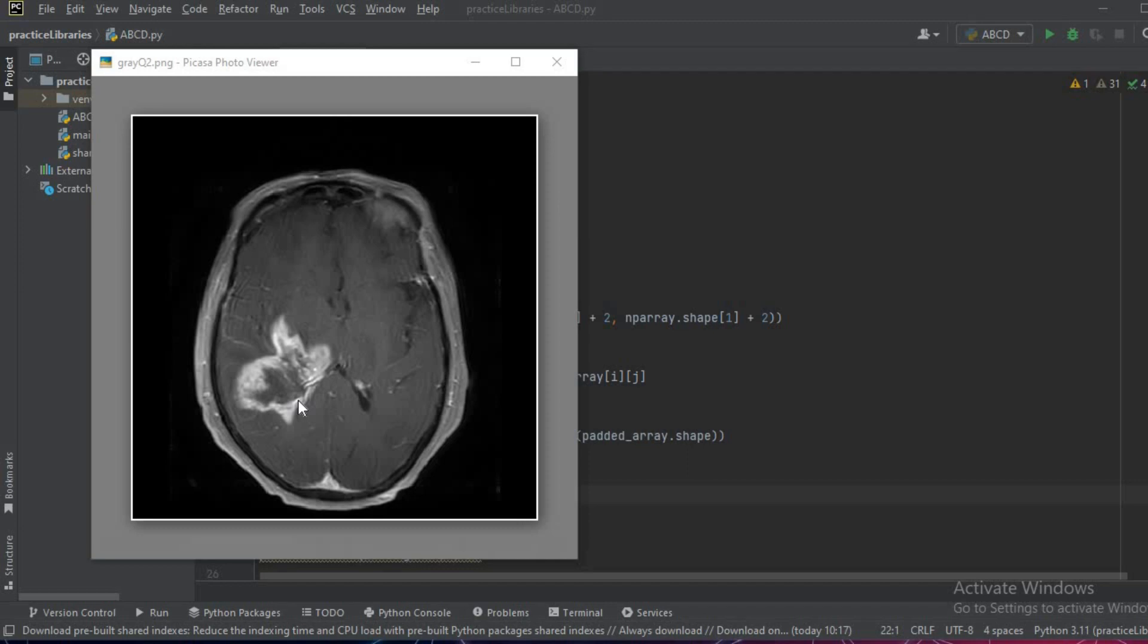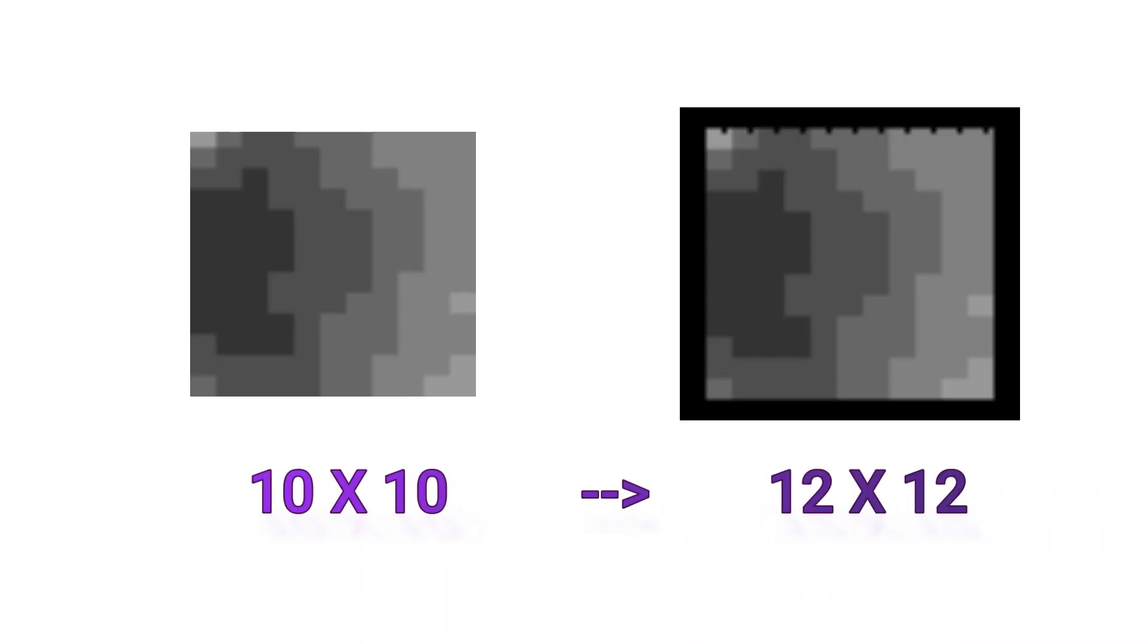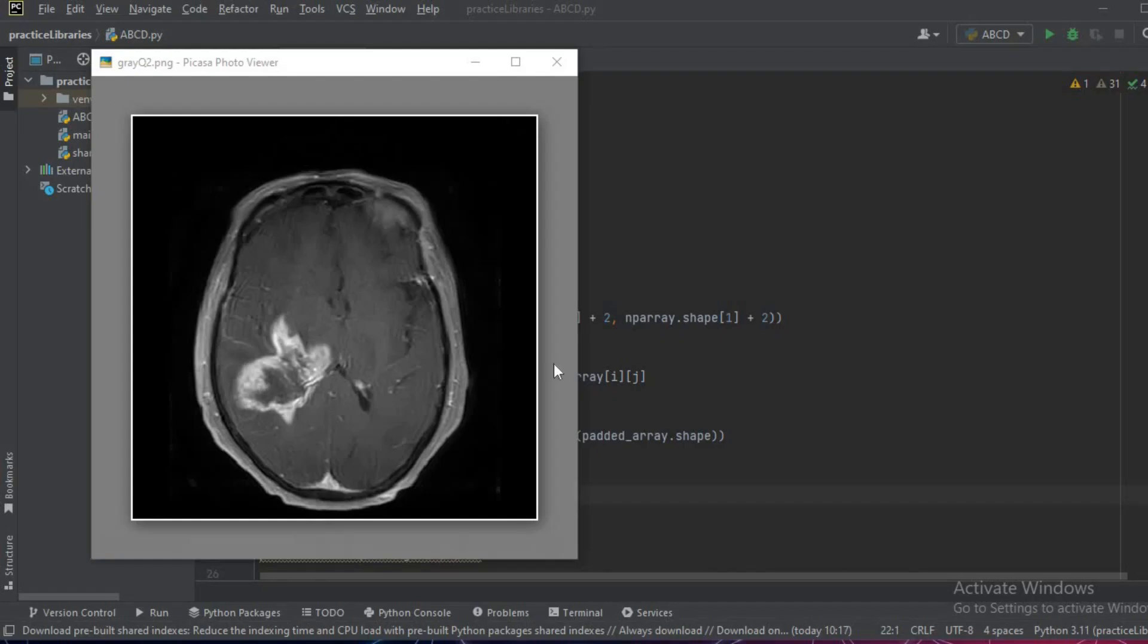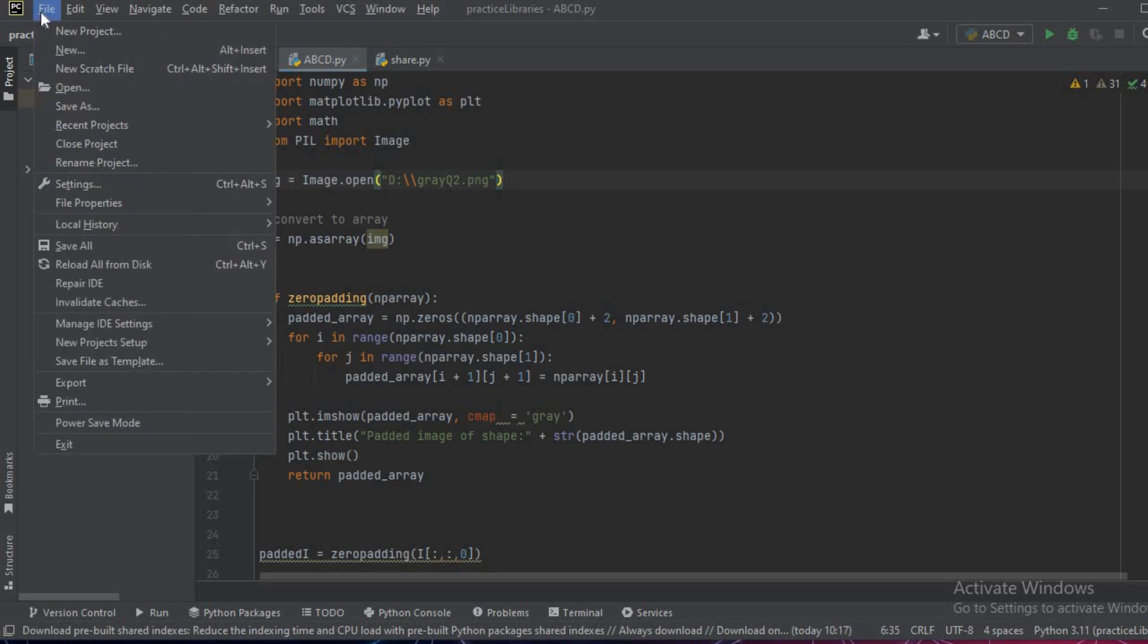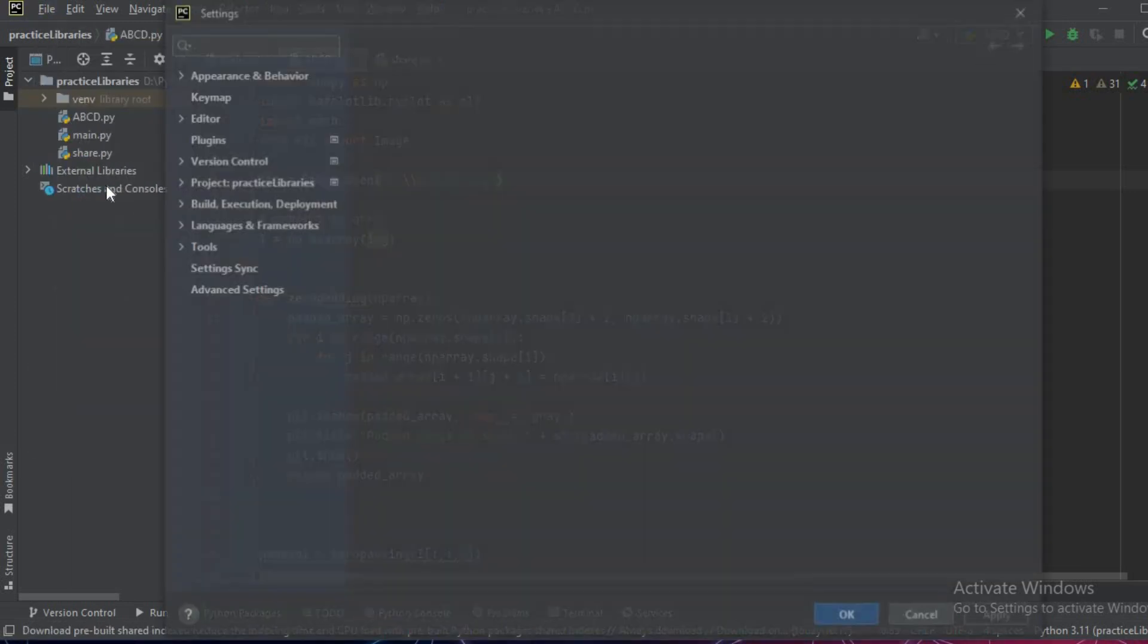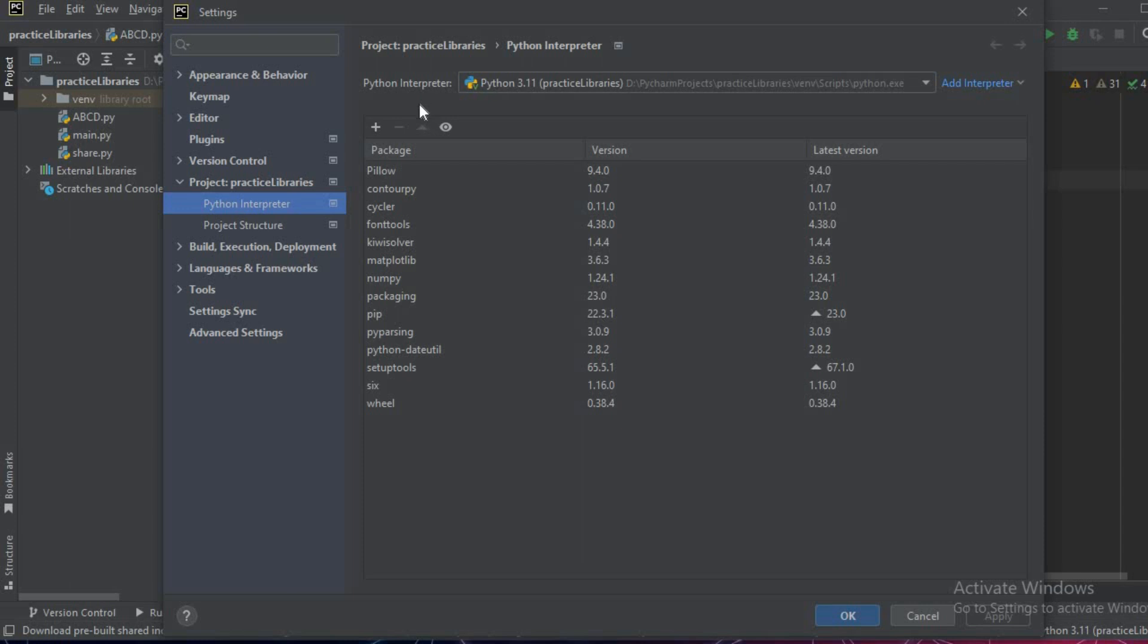In this video we'll see how to perform padding operations on any kind of image. We have this image and we want to perform a padding operation, so we'll be using Python and multiple libraries to do these operations.